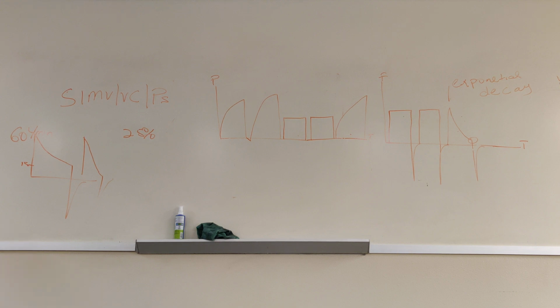See? But now, let's say if I set it very low, I set it at 10%. So that means then that the flow rate would have to decrease almost to baseline here before the patient exhales. What have I done to my I time? Well, my I time has lengthened. And then my E time is shorter now. Is that good for a COPD patient? No. So if you don't set that right, patients can air trap. Okay, or maybe they won't get enough tidal volume. So that's why the optimal setting is about 25 to 30%.